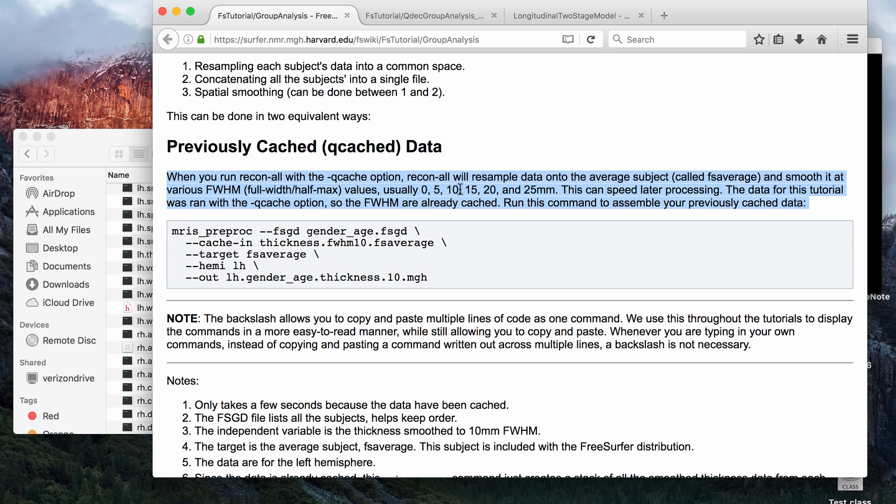Then mapping to FSAverage will also let you look at the differences using an average brain as the template.